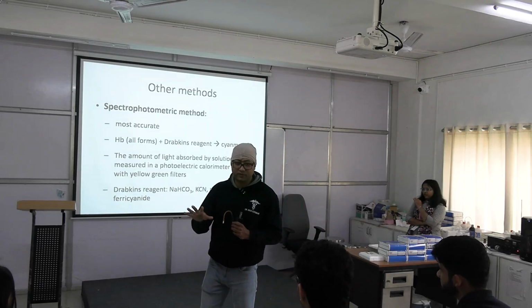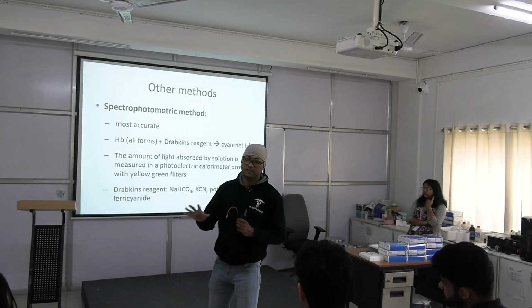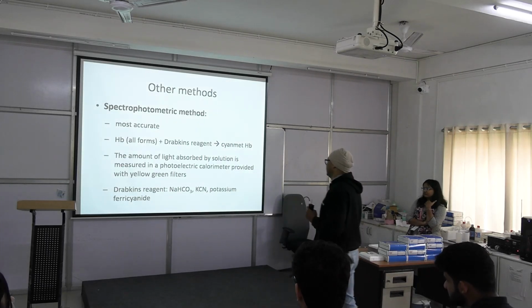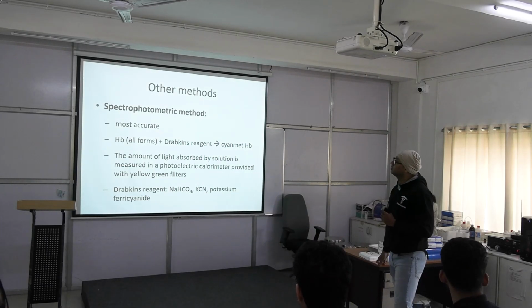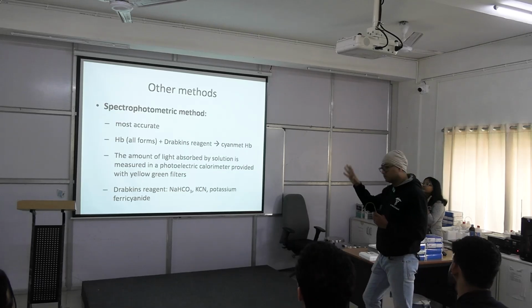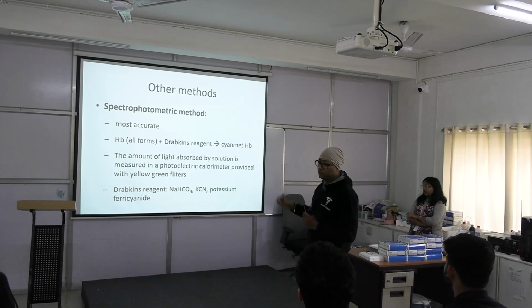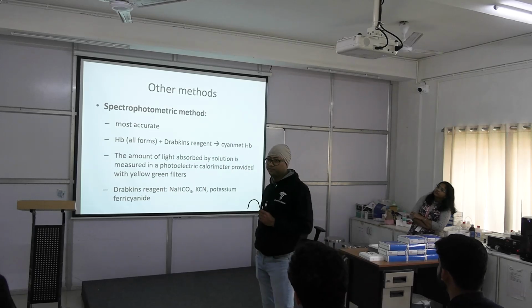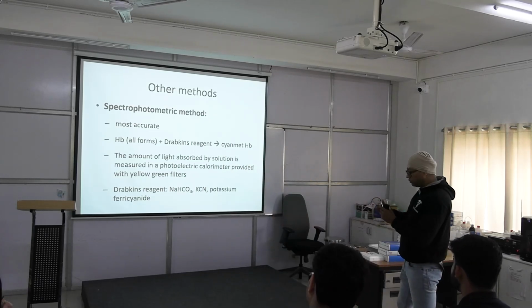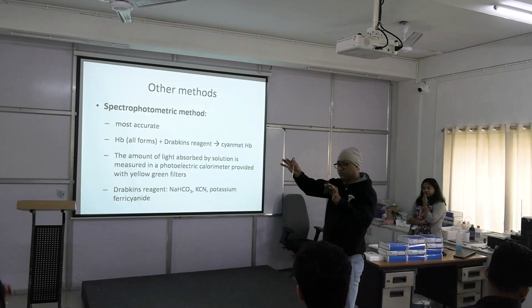The details are not required for your level, okay, until and unless you are doing post graduation in pathology or something like that, right? Okay. So this is the spectrophotometric method, and in all sophisticated labs we use this method. Okay, this is a Viva question for you in practical, right? But you need to perform this Sahli's method here.